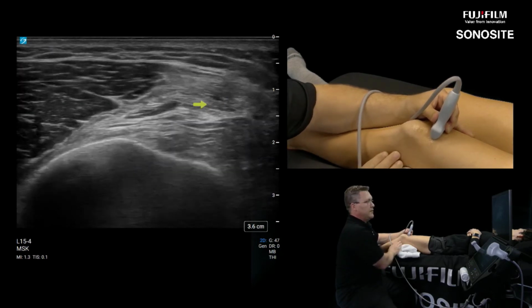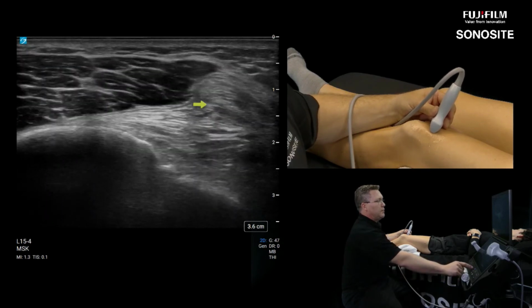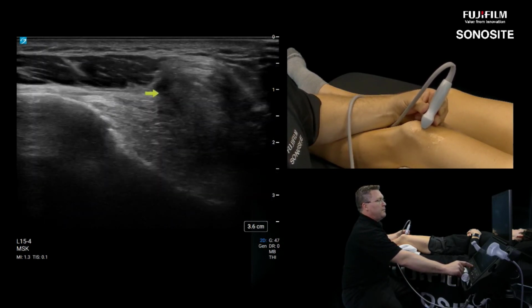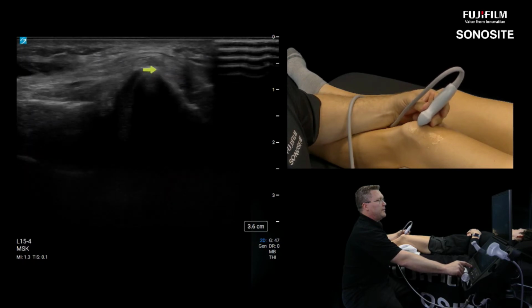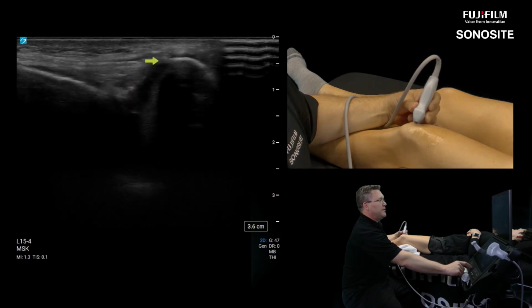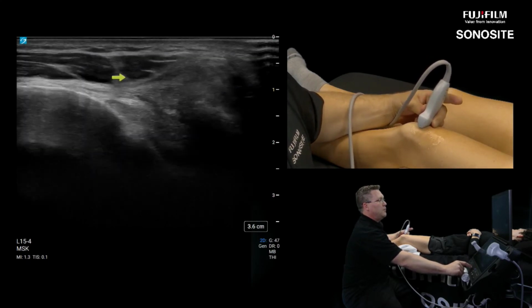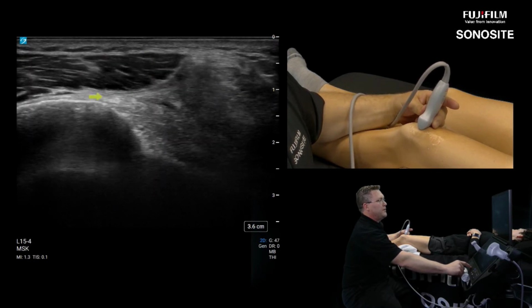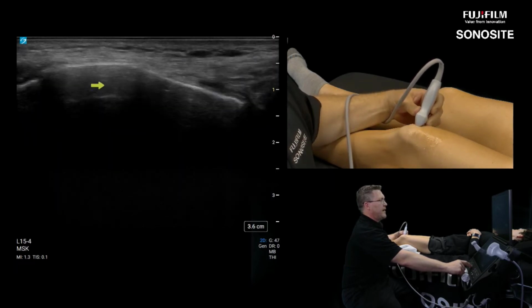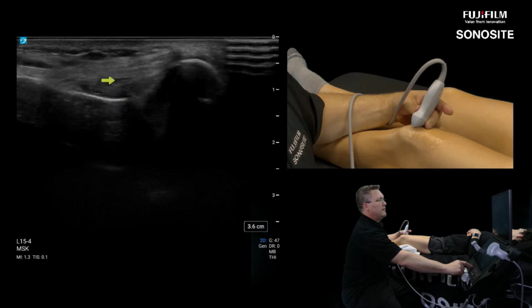Medially, let's come over here medially to the vastus medialis oblique. Okay, and then it's bordering some of the superior retinaculum, the patellofemoral retinaculum here. So we can see the patella medially, going a little bit off the slides here, but here's that retinaculum, and you can see how far proximally it extends underneath the VMO. So here's VMO, here's more of the retinaculum, and it'll go all the way over here to the adductor tubercle, which we'll get into on the medial part of the knee later in the month.